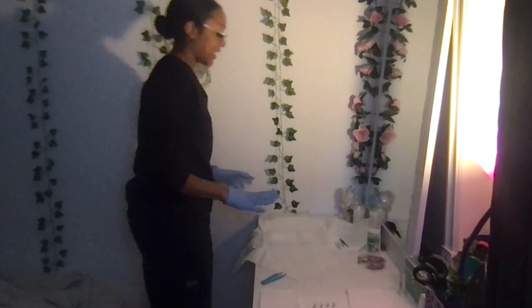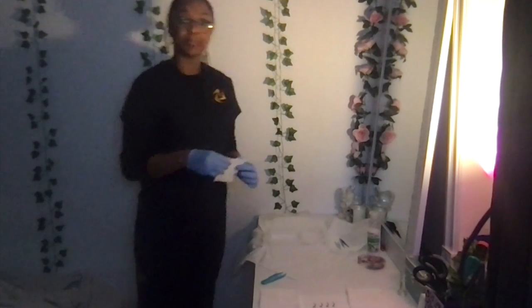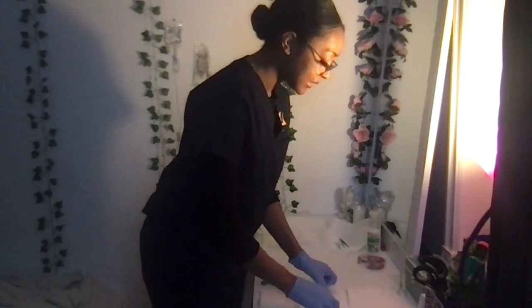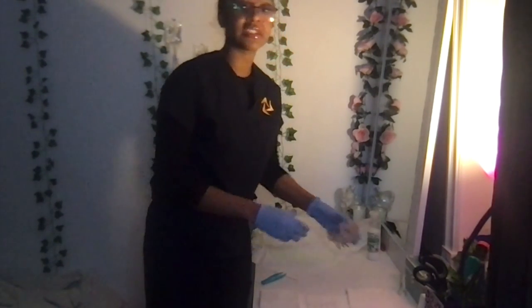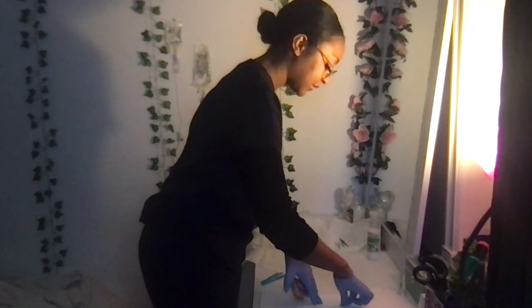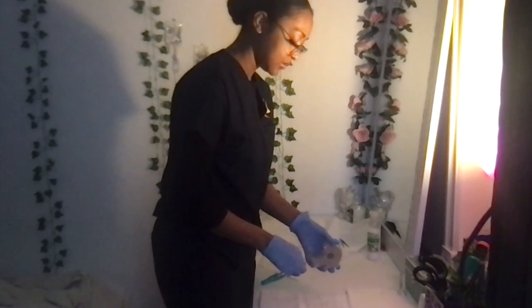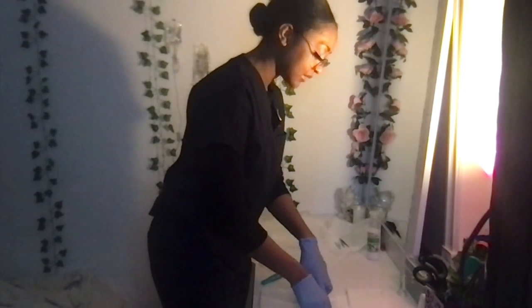Okay, make sure that I maintain sterility, and then I can take my 4x4, place it on top of the wound, and then I will tape it down on each side. Quickly, for the sake of the video, maintaining aseptic technique.